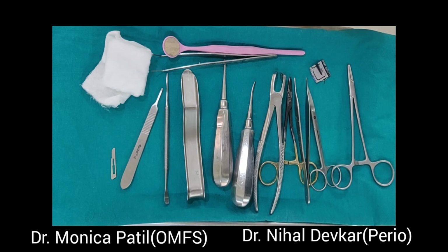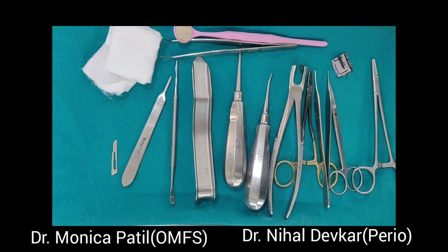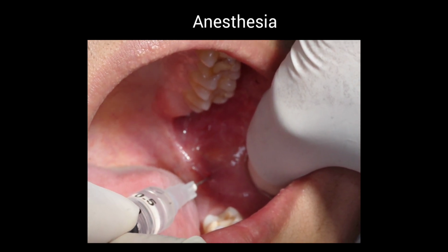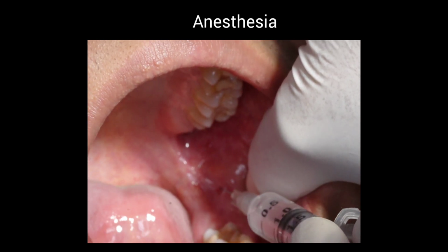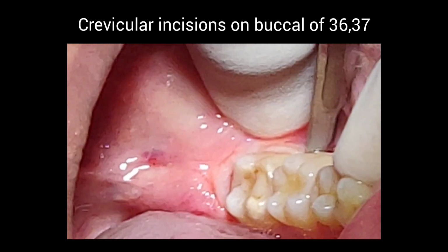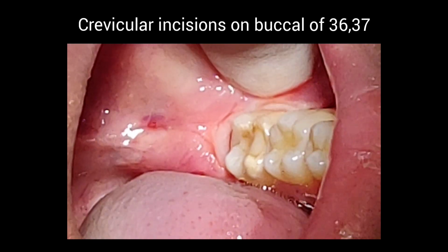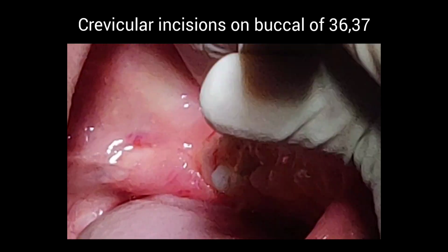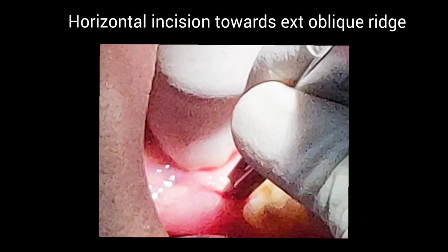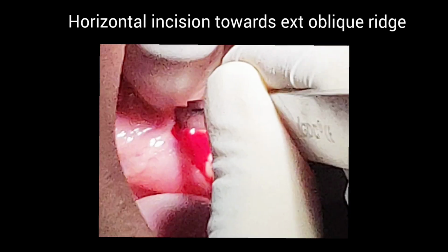The instruments are being laid out, which shows the BP handle with blade, periosteal elevator, retractor, elevators, forceps, needle holder, scissors. Anesthesia is given, both inferior alveolar and lingual nerve block. Afterwards, a crevicular incision is given on the buccal gingiva of 36 and 37 both, continued onto the distal surface of 37 and later continued in a hockey stick manner towards the external oblique ridge.